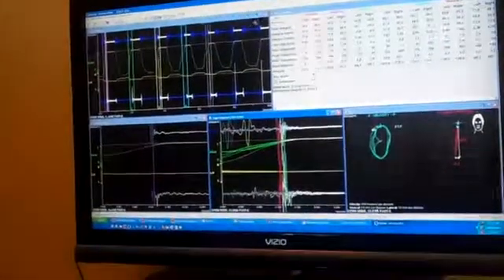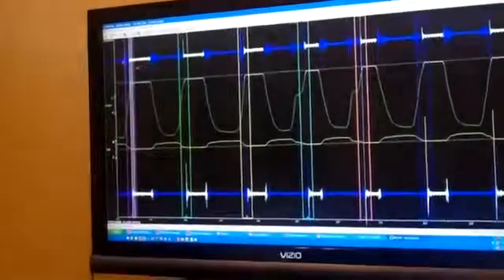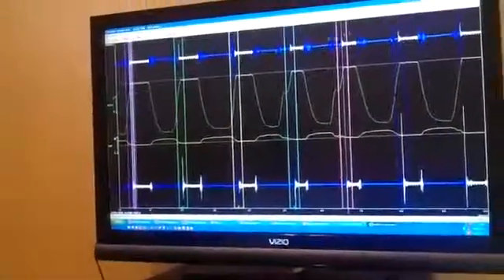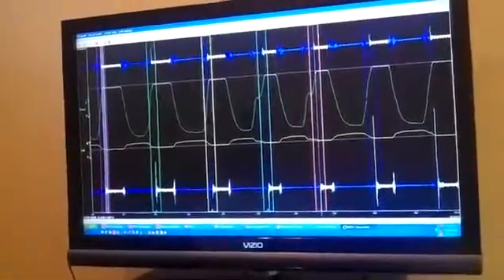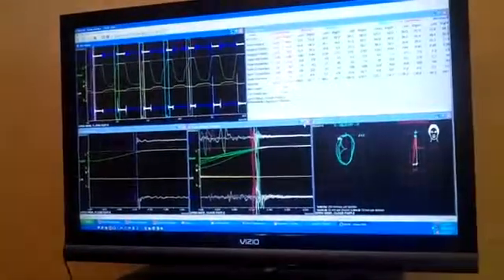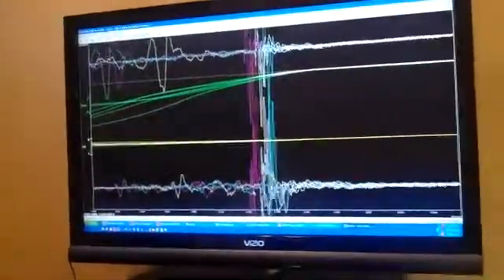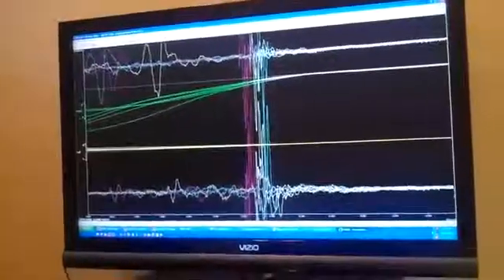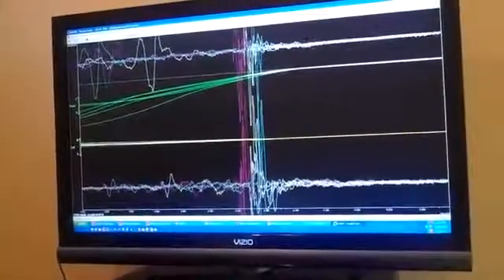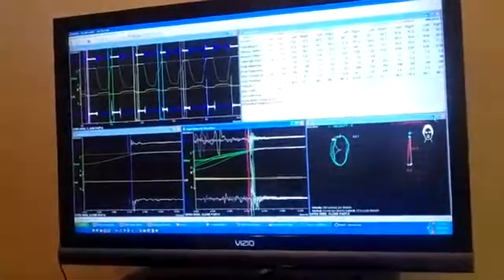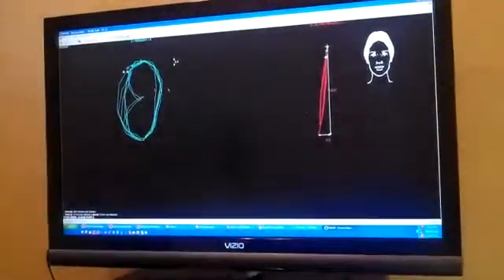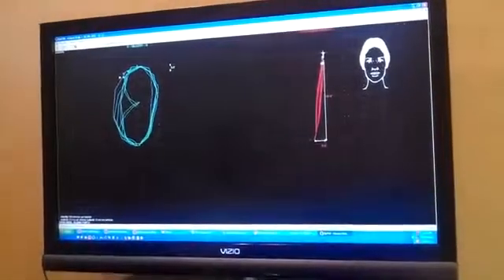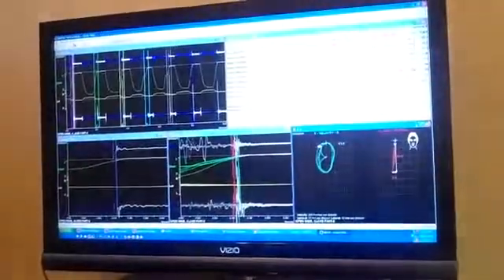This is her joint test, which tells us exactly what's happening. It begins much like an EKG sweep. You can see that I've marked some episodes that were occurring for this particular patient, and we started overlapping to study the episodes and see what they look like. We can see the anatomy of the waves is identical, it doesn't change. And the location of the episode doesn't change either, it's always at the same location.